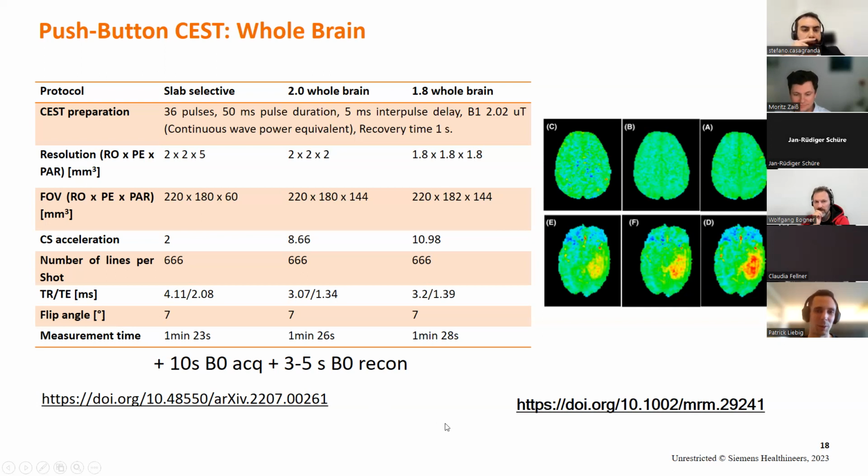The work in progress package, the 816B and C versions, also come with an inline evaluation that is basic in the sense that it does a B0 correction or possibly also a B1 correction, but really very basic, so no PCA denoising or anything fancy. It's really just a linear interpolation.